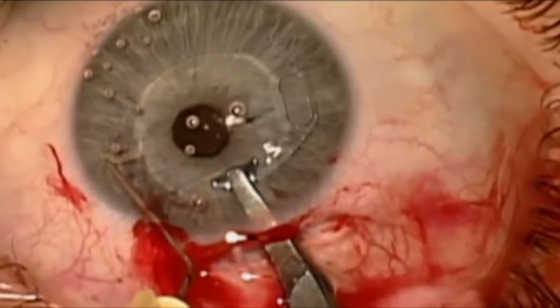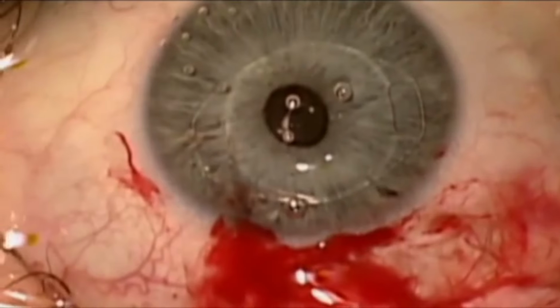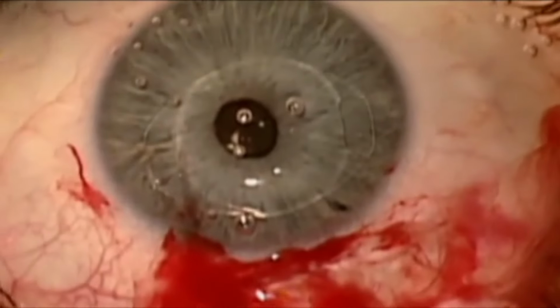A key step in the placement of this lens is the process of securing its clips to the iris, a process called enclavation. As demonstrated here, the lens is placed essentially over the pupil.